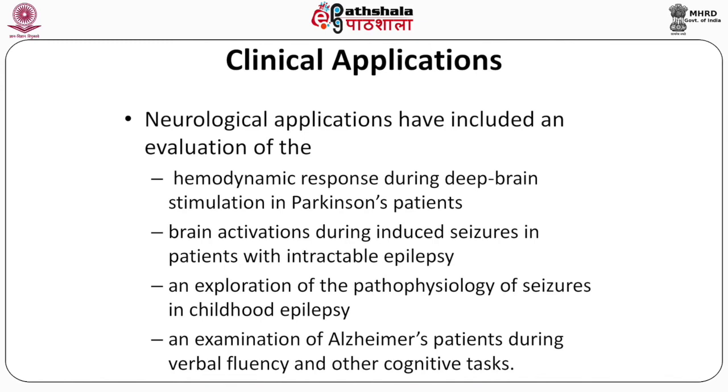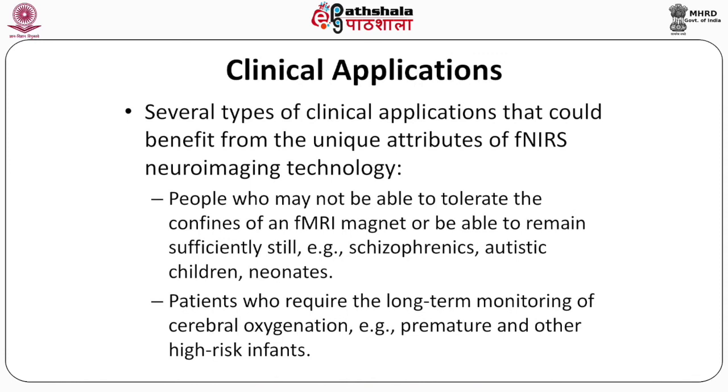Also, we evaluate the exploration of the pathophysiology of seizures, particularly childhood epilepsy. Examination of Alzheimer's patients during verbal fluency and other cognitive tasks has also been done using functional near infrared spectroscopy. Continuing with the clinical application, there are some more clinical applications.